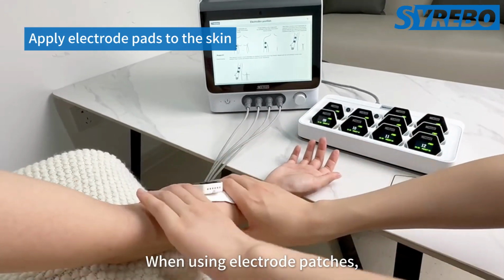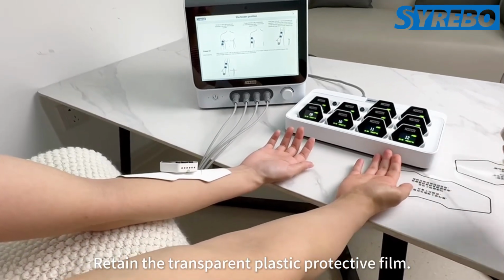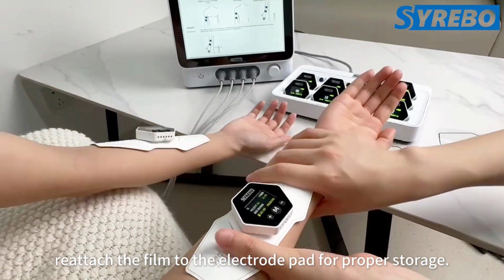When using electrode patches, make sure they are in close contact with the skin. Retain the transparent plastic protective film. After the training is completed, reattach the film to the electrode pads for proper storage.